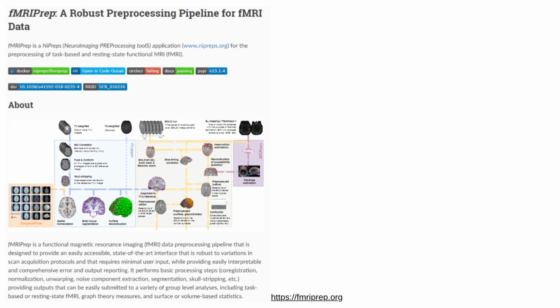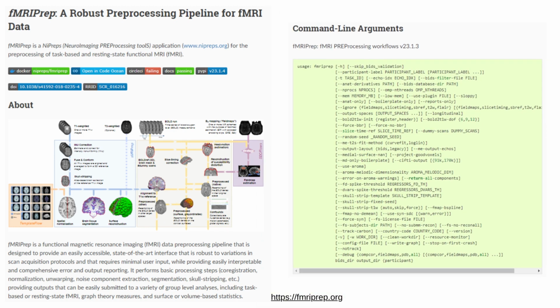Okay, so first a bit of background. If you found this video, you probably know what fMRIPrep is. For those who don't, it's an fMRI pre-processing package that combines best practice tools from a number of different sources. fMRIPrep is great in terms of the fact that it produces well-indexed output that can be flexibly adapted based on the needs of the user.